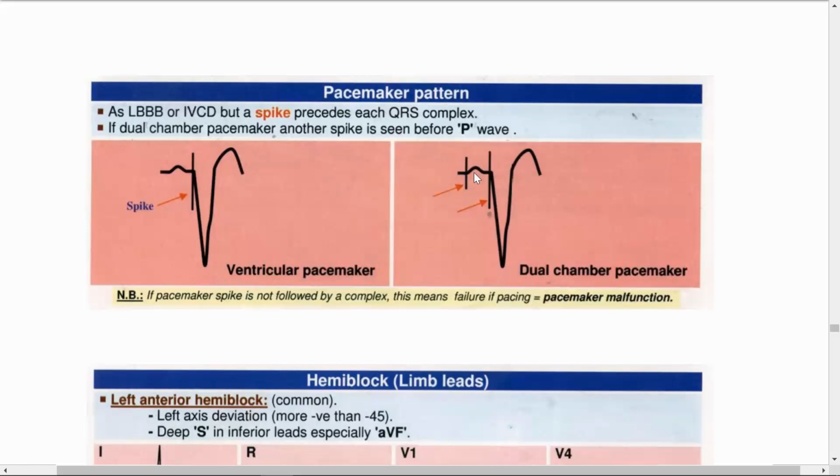Okay. Regarding if the patient has complete heart block, AV nodal dysfunction. So what will be the mode for him? An old patient, 90 years old, with limited mobility. Okay, which mode will be for him? VVI. Yes. There is normal atrial activity.